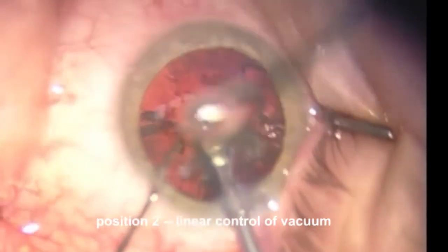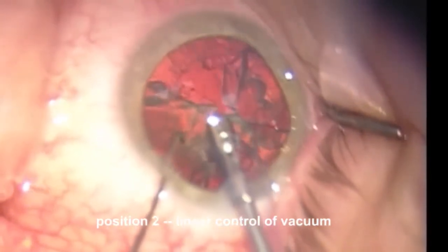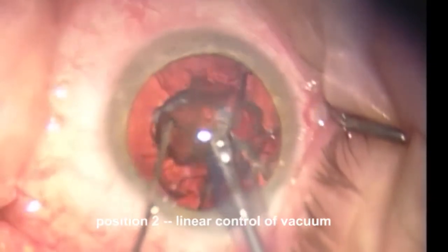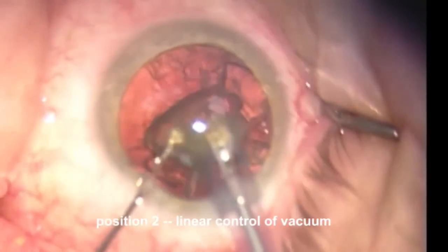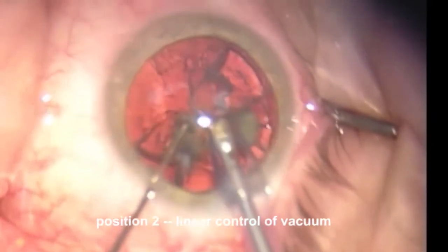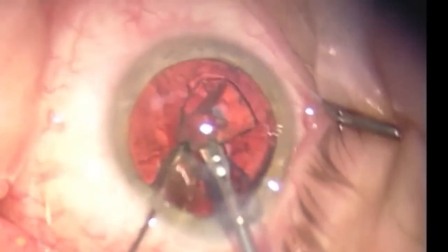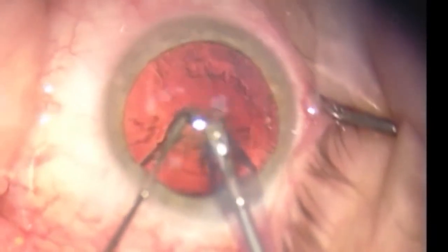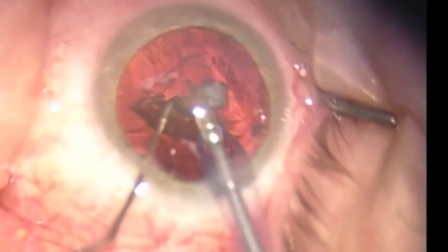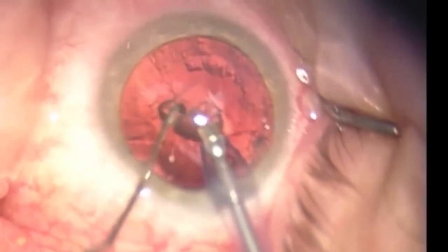You can see how very precise control of the vacuum using the linear control is very useful. We have just a little bit more to go. We could pull that second instrument out at this point — it should be fairly safe. But if you're going to have the second instrument in there, it's nice to have it so that it protects the posterior capsule. So here we're going to put that second instrument posterior to where we're working so that we've got some protection of the posterior capsule should it come in.